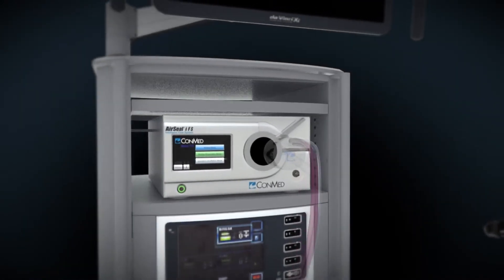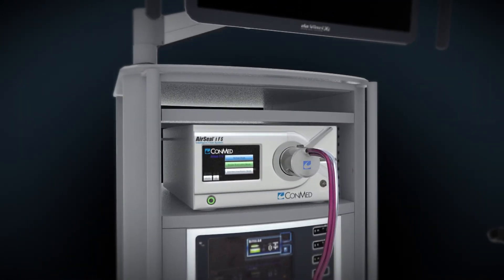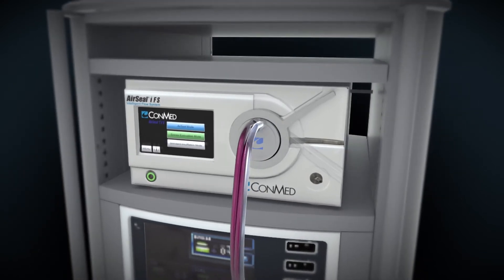Place the filter housing of the bifurcated tri-lumen tube set into the receptacle of the AirSeal IFS and use the locking lever to secure in place.